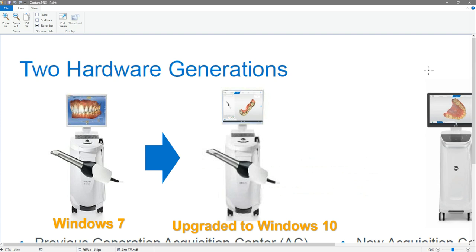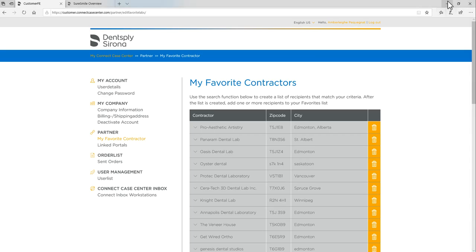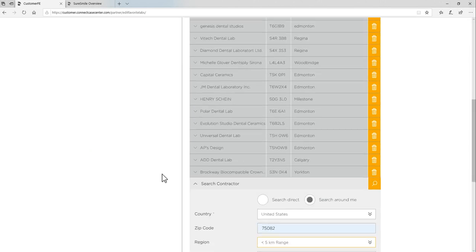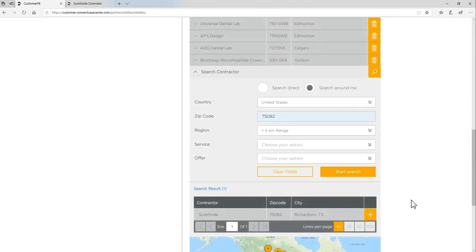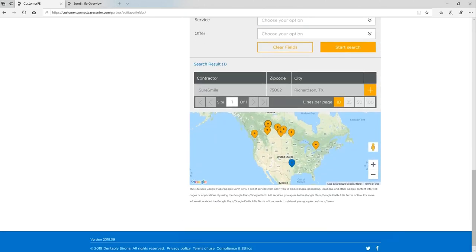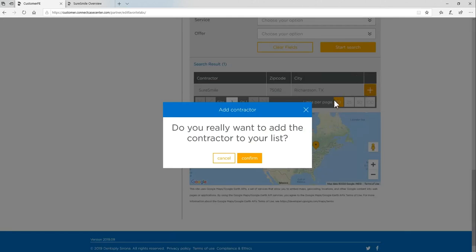Another thing you'll want to do before beginning your first SureSmile case is to log into your Sirona Connect account online and add SureSmile as a favorite contractor. We can do this under the Partner tab on the left-hand side. By scrolling down, we'll find the Search tool. By using the Search tool and searching SureSmile, once they are found, we can use the plus symbol to add them and confirm them as a favorite contractor.